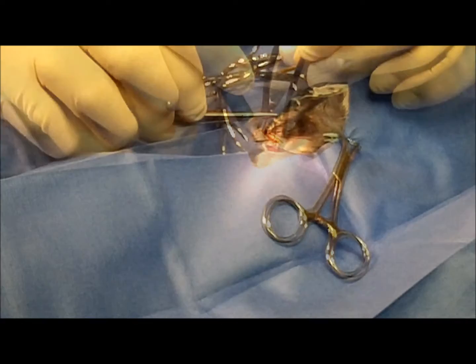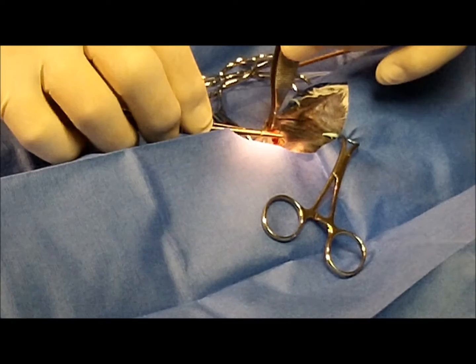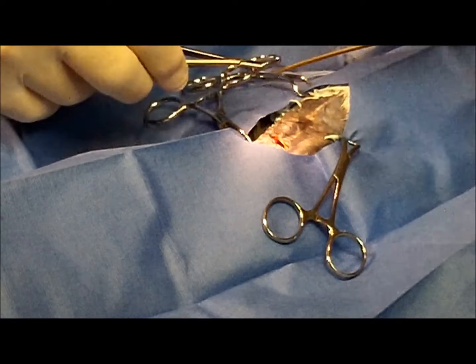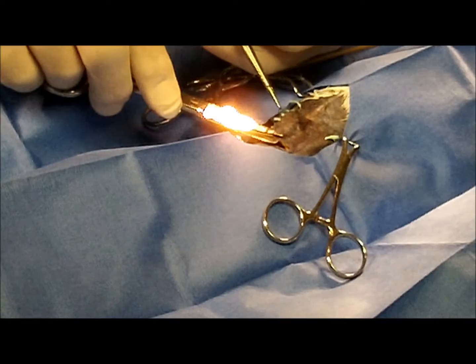We go in and we're going to suture the cloaca to the last ribs on both sides. We're putting in a very fine piece of suture — some 4-0 PDS, which is a monofilament. Making a tie there.